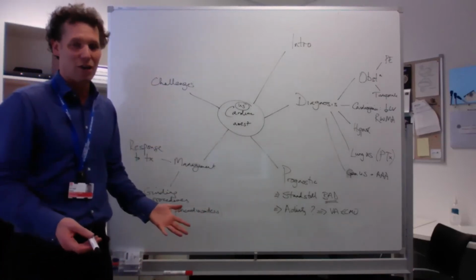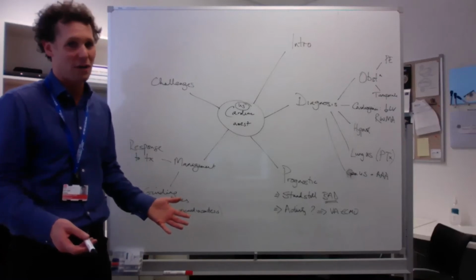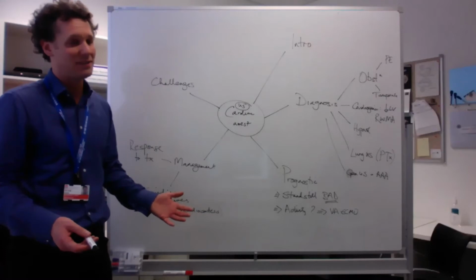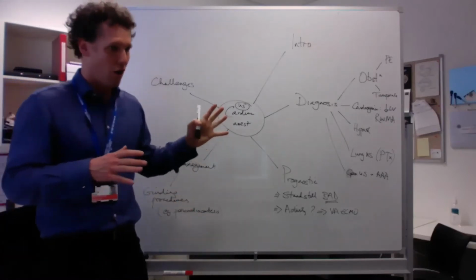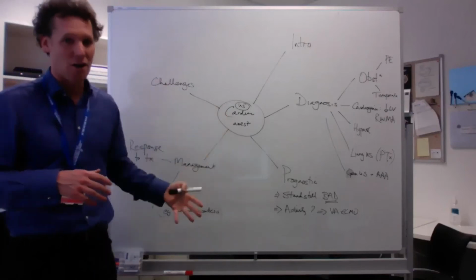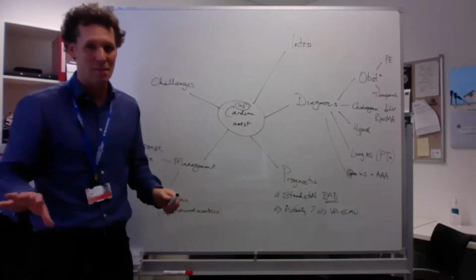You've all done echo during cardiac arrests, I imagine. And I can't be the only one who thinks it's really, really hard, right? So, discuss the use of ultrasound during a cardiac arrest. For me, there are some pretty big motherhood statements to make in there.